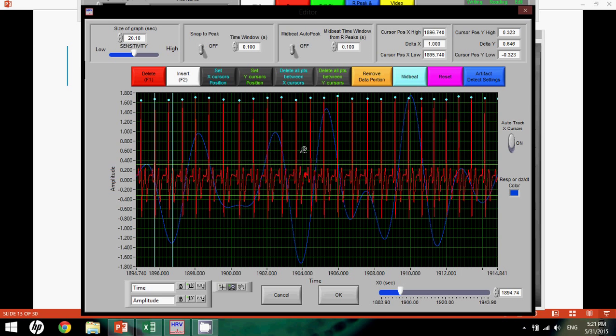So remember that I pointed out in the last video that you're really only going to be focusing on variation on the x-axis and not the y-axis. So it's really not needed to zoom in on the y-axis any more than this. So again, I would suggest using just this, although you see from these other ones that you will have the capability to zoom in other ways. I'm going to skip these for now, just for the fact that I rarely, if ever, use these.